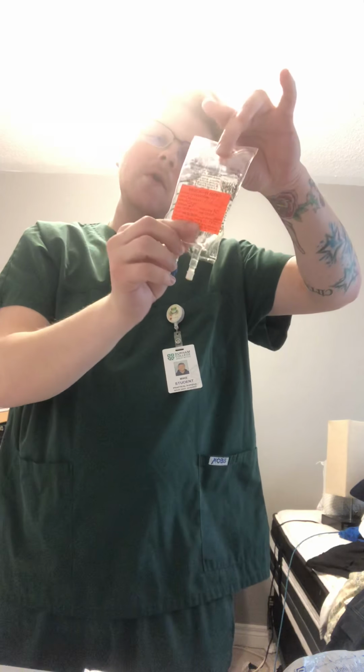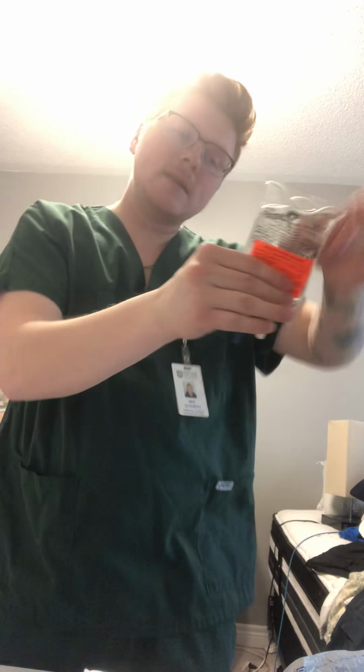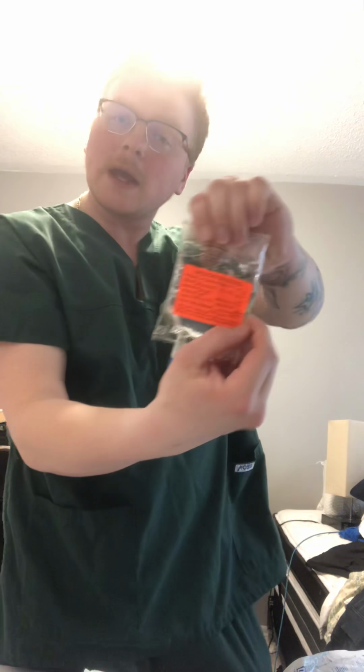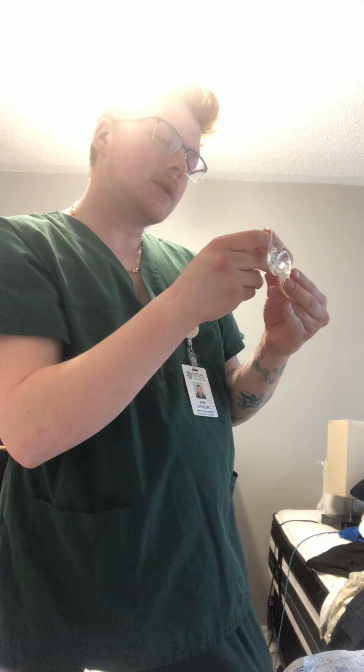and then I would start to visualize and look at my bag, making sure that it's clear without any chunks, there's no leaks, the bag is nice and intact and patent. The label clearly states cefazolin on it, 500 milligrams dissolved in 50 milliliters of normal saline. And then the expiry on this one is December 20th, 2020.